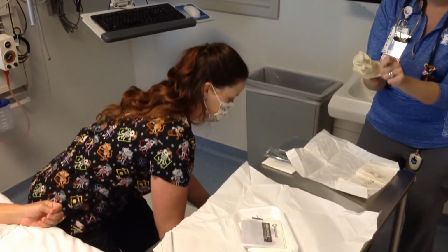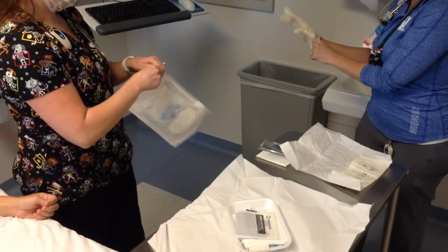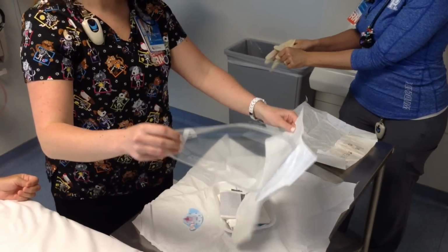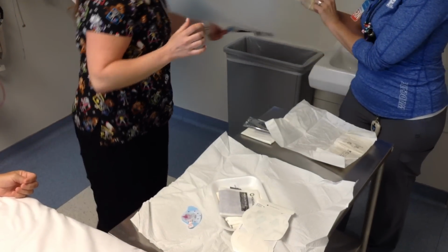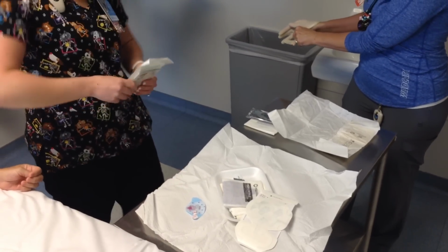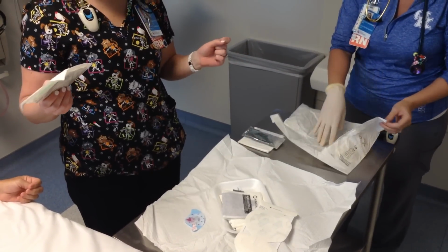So now you want to drop additional supplies needed in the center of the sterile field without touching the field or any of the supplies. Supplies should not extend into the 1-inch border of the sterile workspace. Don't turn your back on your sterile field. If your back is to your sterile field, you will not know if it becomes contaminated.